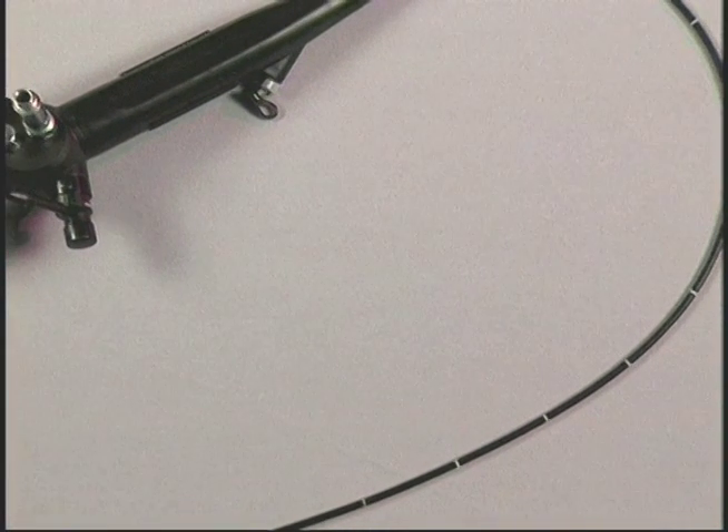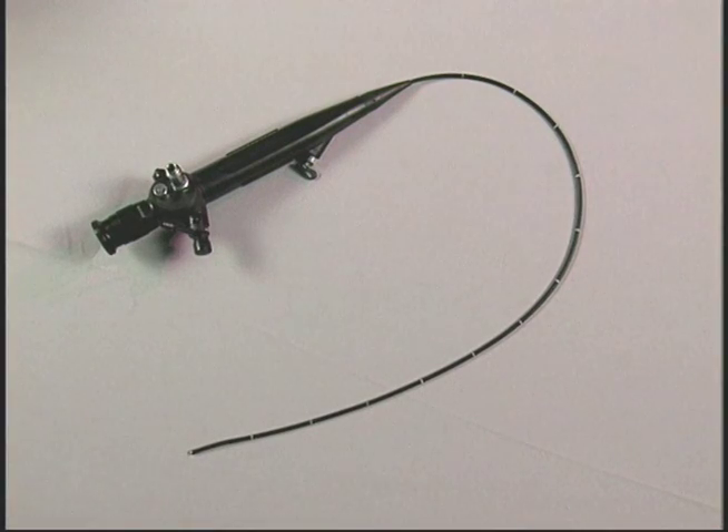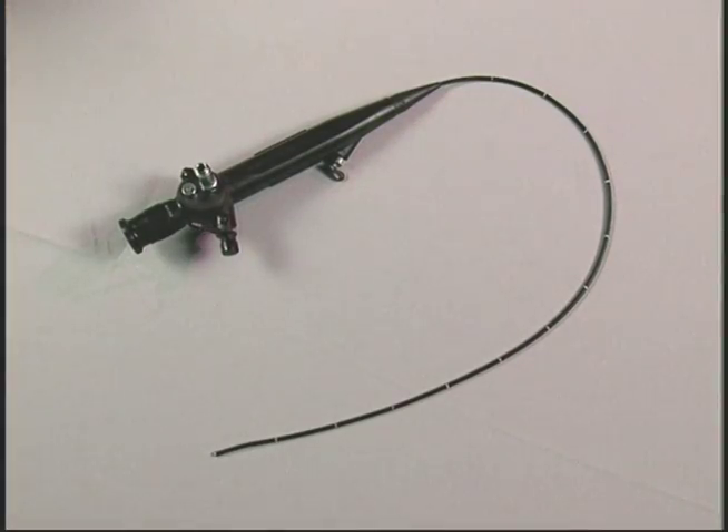In order to protect patients and medical staff, Karl Stortz flexible intubation endoscopes must be thoroughly cleaned according to validated infection control procedures prior to use and subsequent reuse.